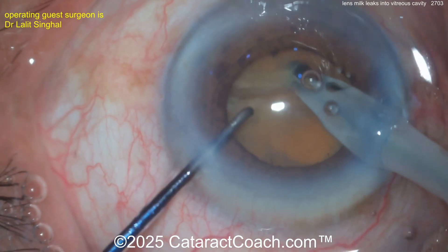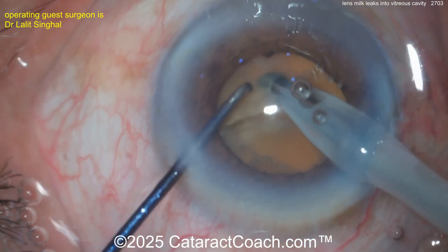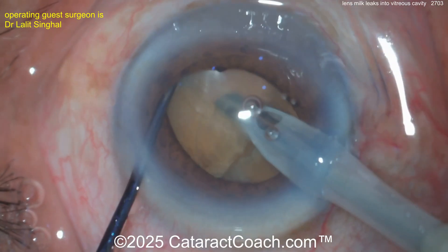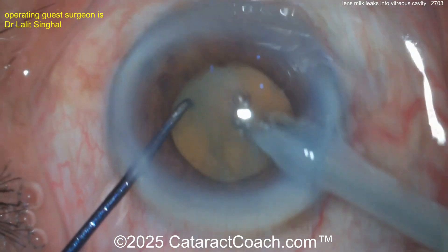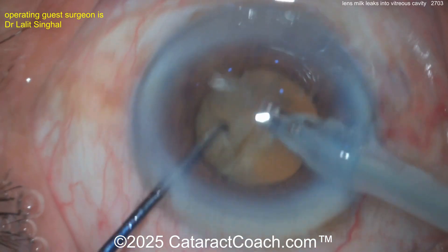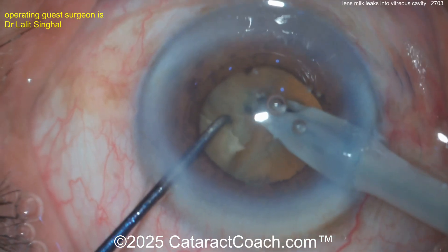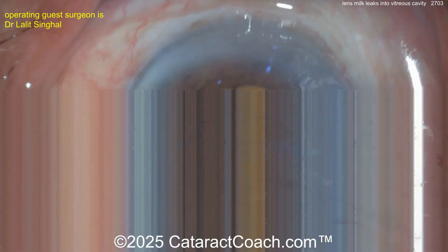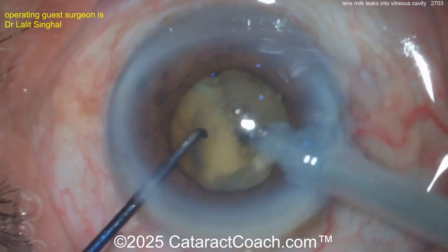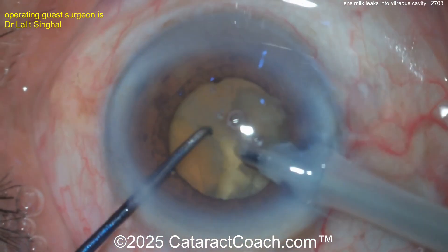Buzzing with the phaco probe, getting that chopper around the equator, applying counter-traction — that's reasonable. You may have to take your time on a brunescent lens like this where it's really dense, fibrous, and leathery. Sometimes it's difficult to get the chops to fully propagate. Buzzing again with the phaco probe — slowly but surely you'll get through this nucleus.